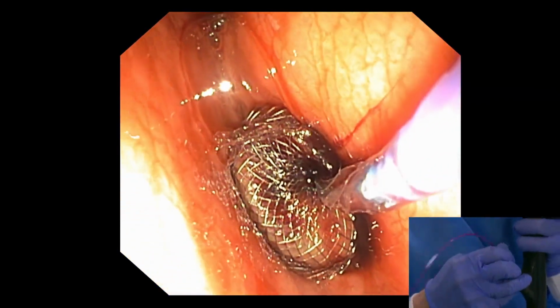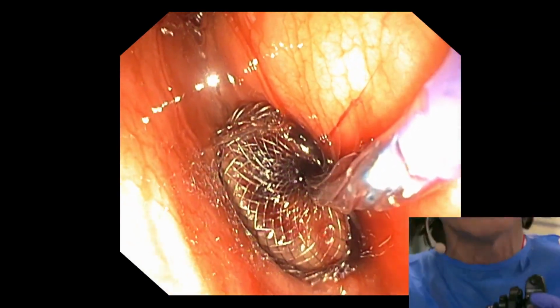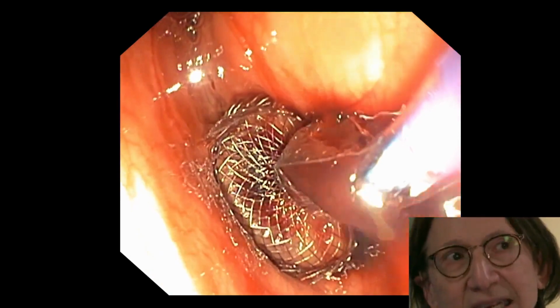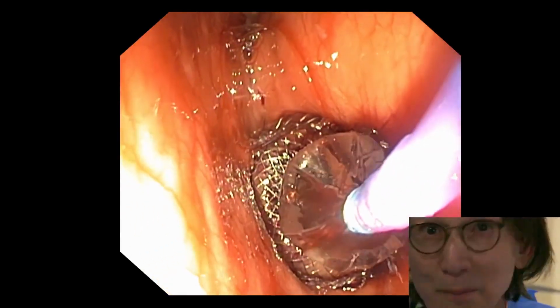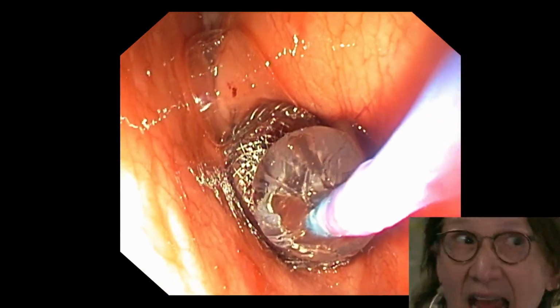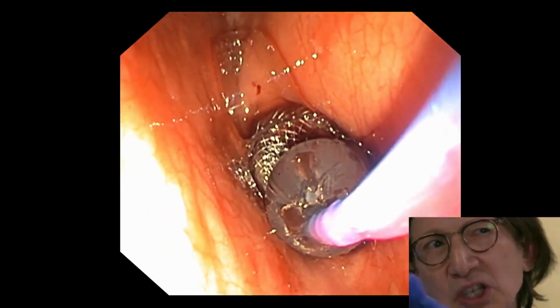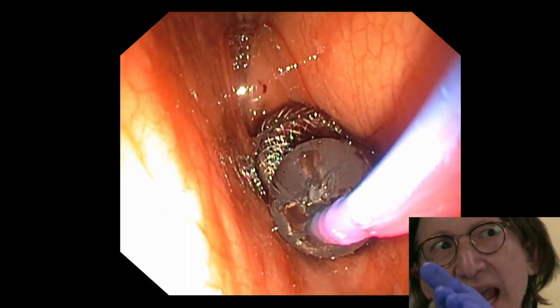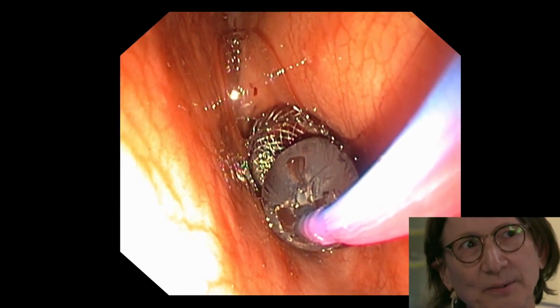And now start to dilate, please. You can see the pink at the top. That's the end. Start to dilate to 15. That's the first step. And I'm going to try to keep myself as perpendicular to the axis as possible. Right? So I'm pushing in, and I'm pushing the balloon so it is in the axis of the saddle.